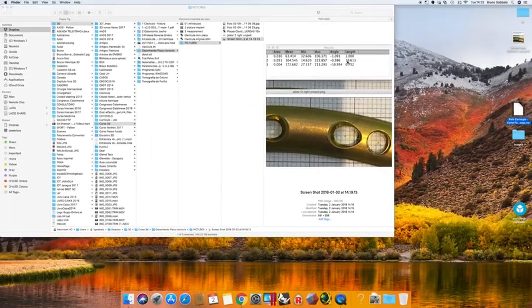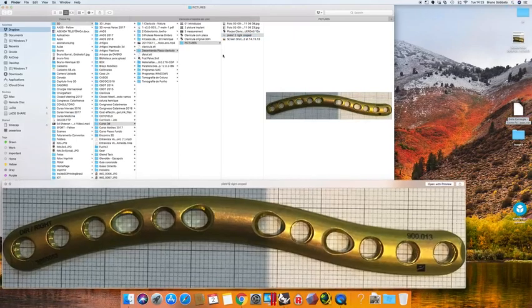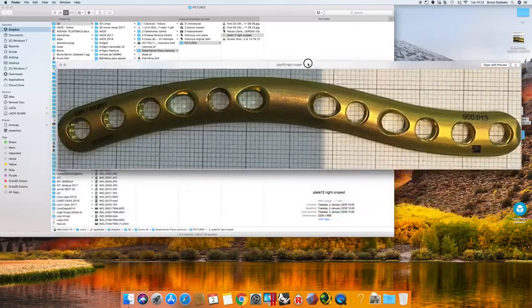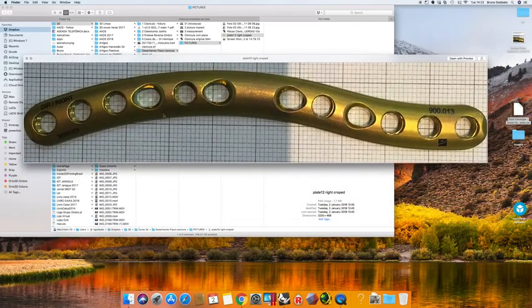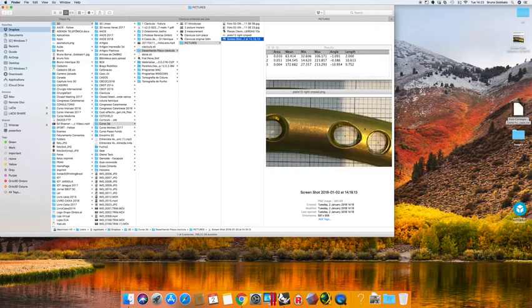We have just measured it. And we know that this image we have cropped, that file has 10.6 centimeters. So this is the big tip for designing implants: to have the picture cropped correctly and at the correct size. 10.6 is what we measured, okay?